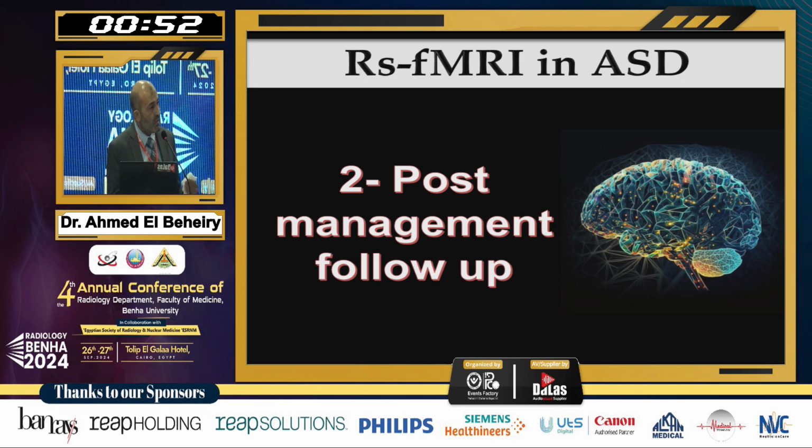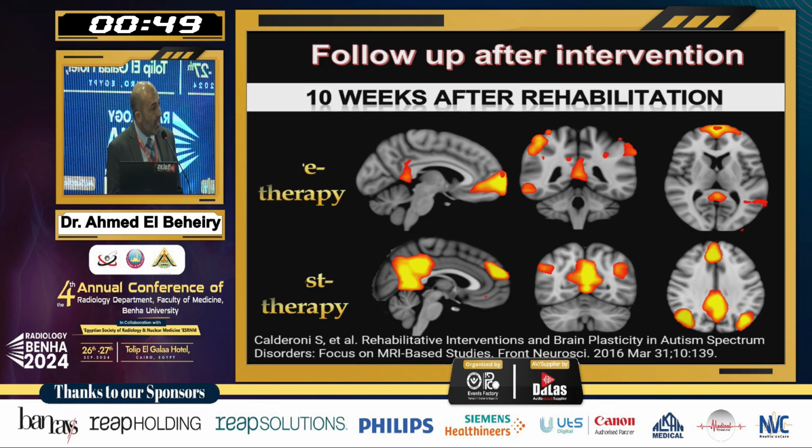Lastly, the post-management follow-up. Here we can see the difference between the DMN, or the default mode network, prior to therapy in the first row, and 10 weeks after neurorehabilitation, you can see increase in the signal intensity and the volume of the components of the DMN.